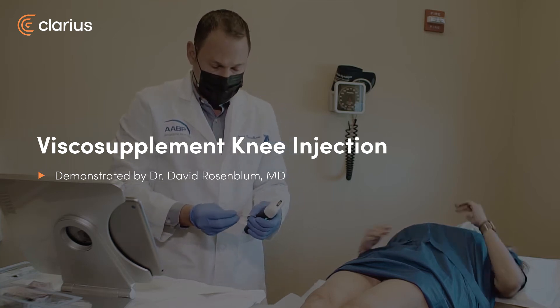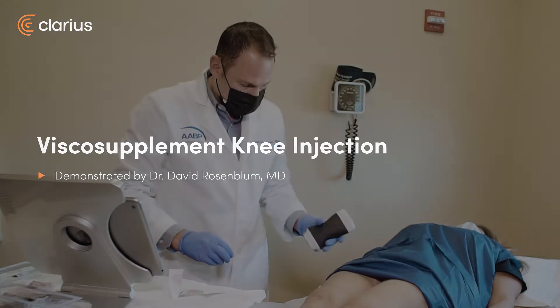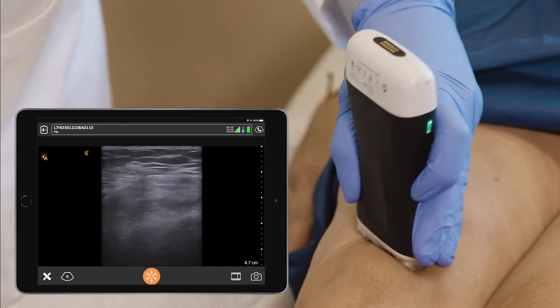This patient is here for a visco supplement of the knee. This is her third injection, and she's overall doing okay with the injections. Which knee was worse? It's my right knee. Your right knee — okay, well that's what we're starting at right now.